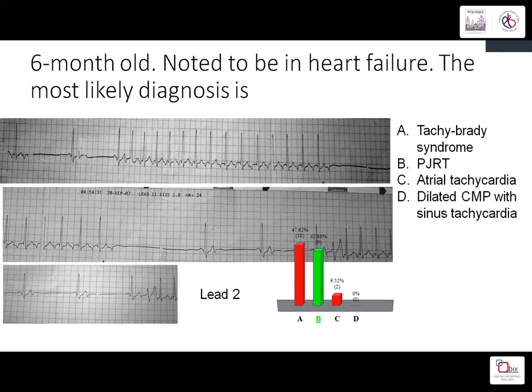Okay, ectopic atrial tachycardia has a P configuration different from the sinus P. But the way it is behaving, it comes for 2 seconds, goes off, again lasts for a minute and goes off. This is quite characteristic of PJRT. Usual ectopic atrial tachycardias will be on continuously, and if you terminate them, they will remain terminated for long. In a single Holter, we don't see this kind of batches of tachycardia and non-tachycardia, and other features, whatever Dr. Narayan has described, make PJRT the first choice.